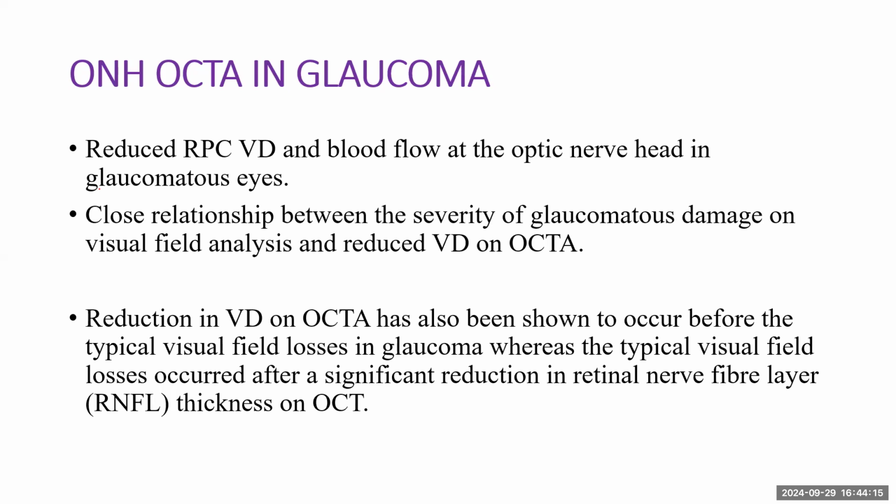And so that is easy to accept in terms of OCT coming ahead of visual field changes in detecting glaucoma, being that you need to lose fibers to a particular quantity, 50 to 75, to get the typical visual field changes on white perimetry.